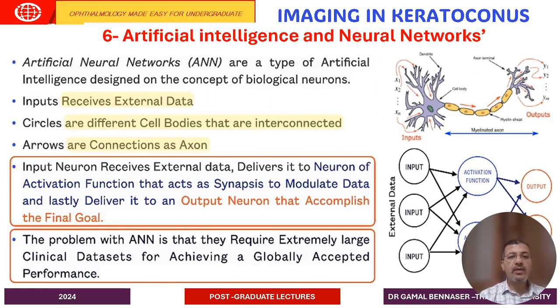Now, recently, the use of AI, or artificial intelligence, in the clinical field has very wide applications, especially in ophthalmology, because of pattern detection and because we depend mainly on a large number of images: topography, tomography, corneal biomechanics, electron microscopy, and also collagen imaging in the form of polarization sensitive imaging. All these data make it difficult for us as clinicians to memorize and categorize whether a patient is a good candidate for a type of treatment or not.